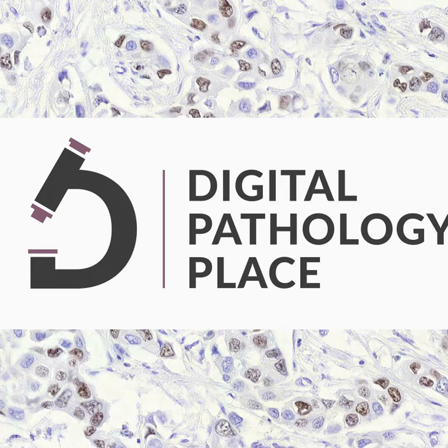And I'm also thinking, okay, then how can you leverage the fact, for efficiency, for reducing the size of images, that you just mentioned most of the diagnoses are a low power diagnosis, or low power diagnosis with high power confirmation? Like you look at low power and you see the focus and you just go to the focus of whatever you're interested in. You don't need the whole image at 40x.